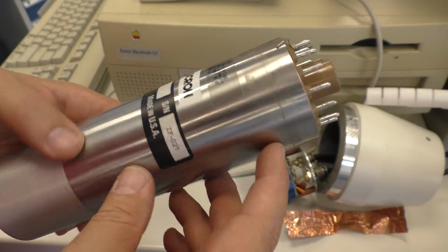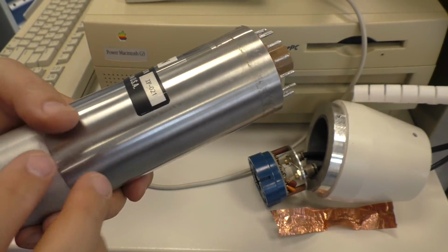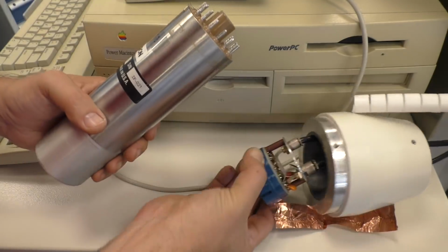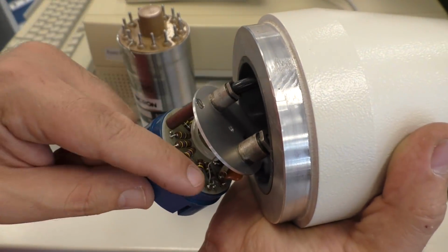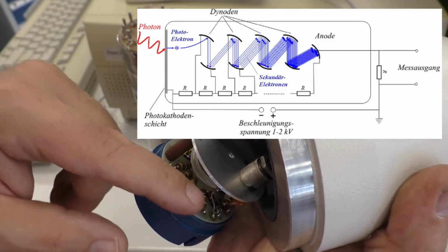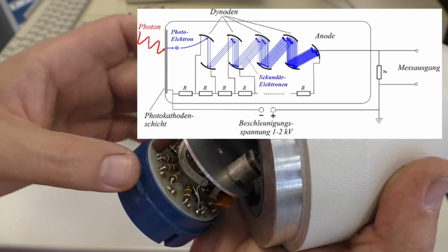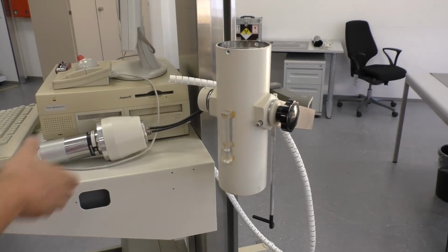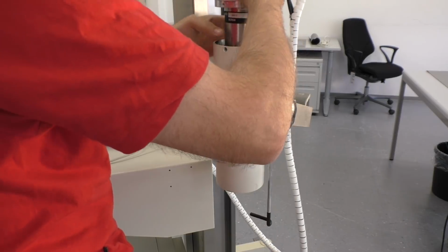the image intensifier tube, or well, not an image intensifier, it's a photomultiplier, because you want to measure single photons that have to be amplified here. Yeah, also the board here looks like the connection board of a photomultiplier, because the photomultiplier has several electrodes and each one needs a little bit higher voltage than the one before, and that is easy done with these resistors that go from one electrode to the next, and so they make a voltage divider. Passive resistors, that's it. Well, I'm putting everything together because this time I really want to see how this thing works, if it still works.